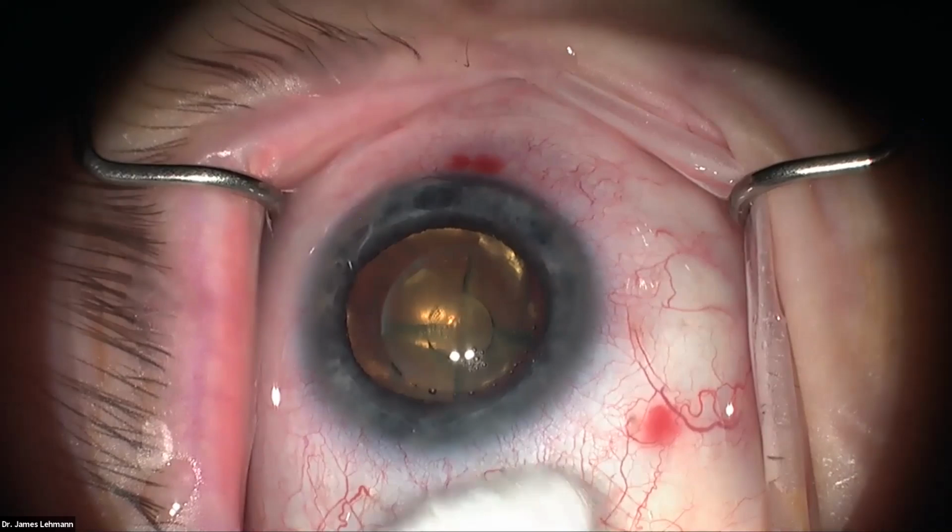So Dr. Lehmann is going to do the first case today, where he's going to demonstrate all the fundamentals of phaco in a 3+ NSC PSC that has received prior treatment with femtosecond laser. The advantages of that are not only does it help with the wound construction and the CCC, but it also can help with nucleus disassembly, so that you'll have ideal viewing of how he's going to disassemble this nucleus and remove it by phacoemulsification technique.